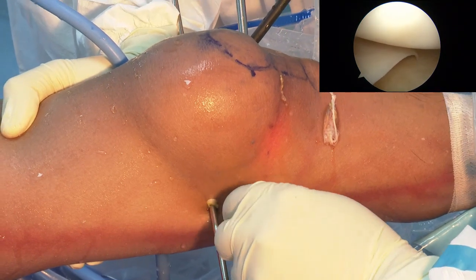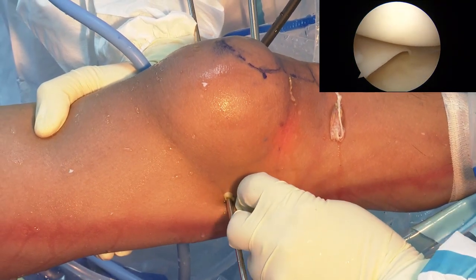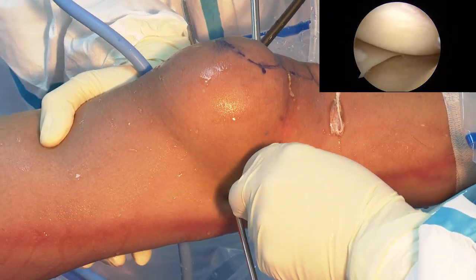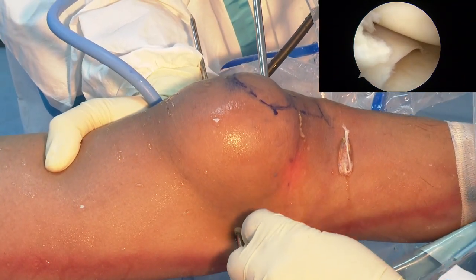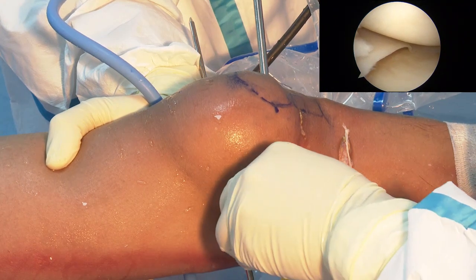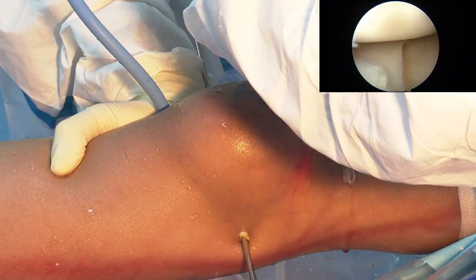那注意观察镜下，每穿刺一点，镜下就会看到 at the femoral attachment 增加。Sorry that we didn't have the right instrument. 因为今天工具呢跟手术室的不一样，所以 sorry，操作演示起来会有点难度。Okay, maybe later. If you touch at the right point, it will open immediately. 那一般手术的话，每扎一针都能看到显露的增加。Later, maybe we find some more instrument.